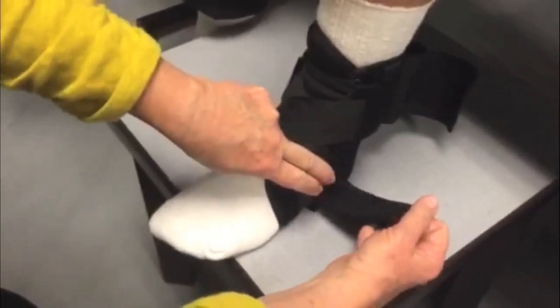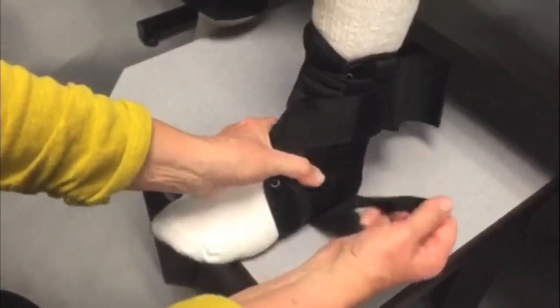With your foot flat, release the outside stabilizer strap, evert your ankle joint as much as possible, and reattach the strap. This will help prevent a future inversion sprain.